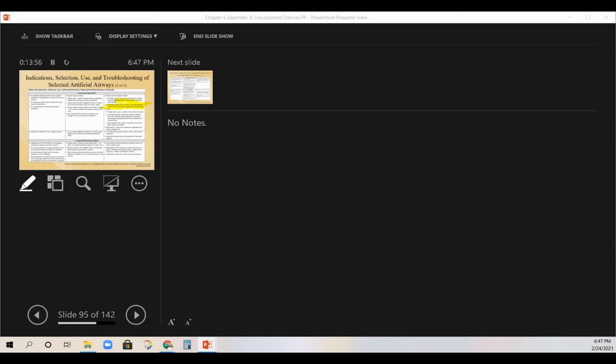Leaks: if a large leak occurs, you're going to reinflate the cuff and recheck the leak. If the leak persists, check that pilot balloon, inflation line, and valve for leaks. Bypass by inserting a small gauge needle with a 3-way stopcock into the pilot line. If the inflation line system is leak-free, the cuff is likely blown, and you reintubate, okay? So obstruction: follow the obstruction algorithm that we're going to talk about in chapter 15.